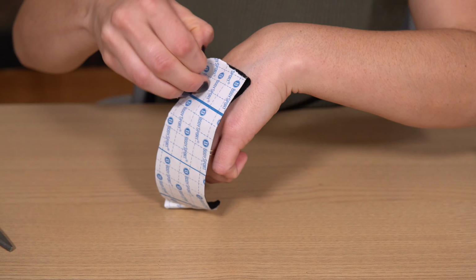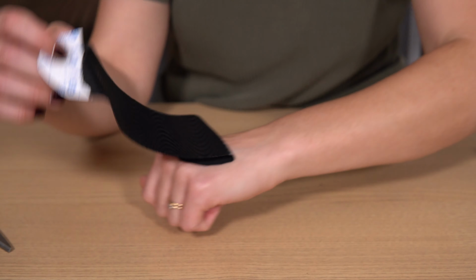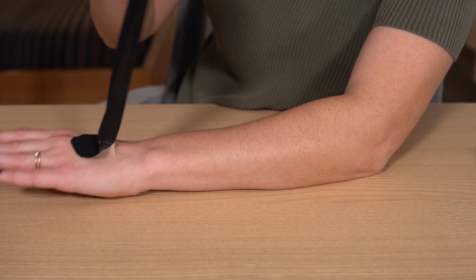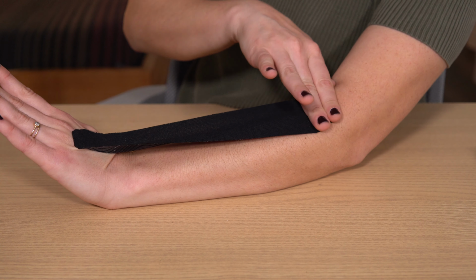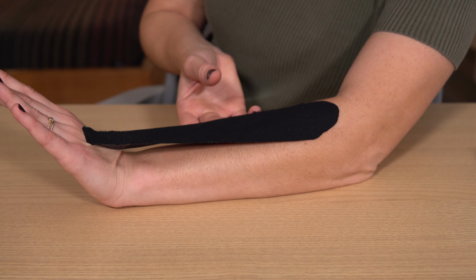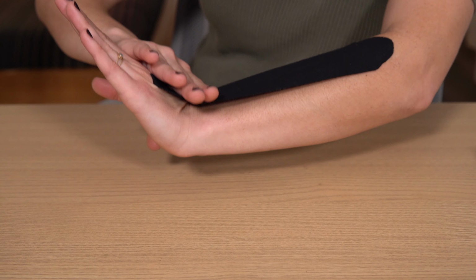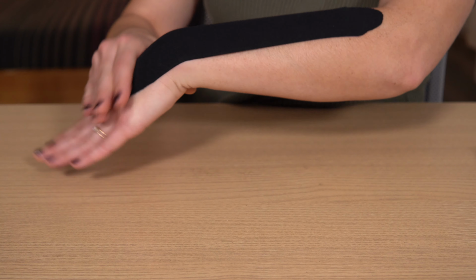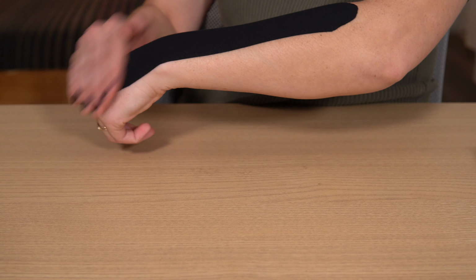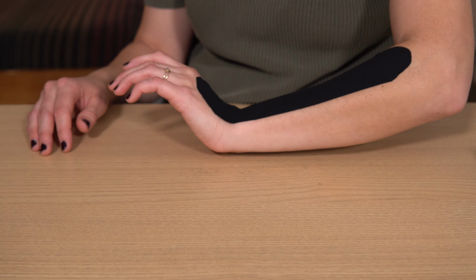Now, we are ready to remove the rest of the paper backing from the main part. And this is where we are going to put a little bit of stretch on the tape. However, we want to make sure that when you're placing the second anchoring point up by your elbow, your hand is bent back in wrist extension, meaning you're extending your wrist back so that you've got that little bridge between the tape and your arm. When you're ready to push the tape down, you're going to push your wrist into a bent position or flexion and then rub the tape down. And that's going to create that tension that's going to give your wrist that cue to lift up and back.